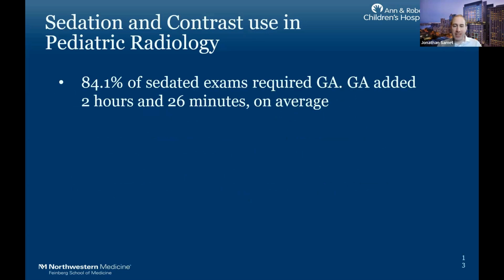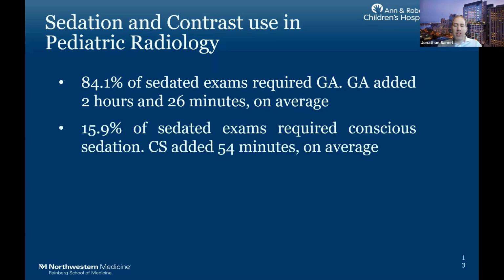84% of the sedated exams required GA. That's just our institution. Everything's different depending on if you have a conscious sedation service. GA added about 2.5 hours to just your encounter, your time in the hospital.